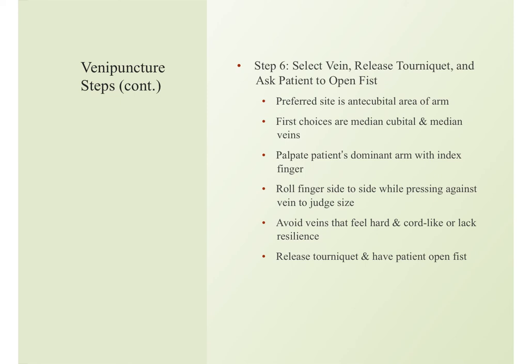I always recommend doing it. I inspect the area first. I choose where I'm going to start palpating, close my eyes and start palpating, kind of palpate from the middle out, okay? And I'm also, with my eyes closed, visualizing what that vein looks like under the skin and how it runs. So that when I put that needle in, if I need to adjust, I've got that map in my mind of that vein and where I'm headed, okay?